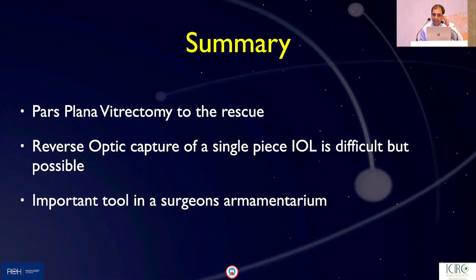So pars plana did come to the rescue, and reverse optic capture of a single piece IOL, although difficult, is possible, and I think it's an important tool to have in a surgeon's armamentarium.